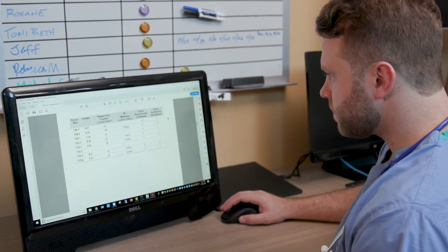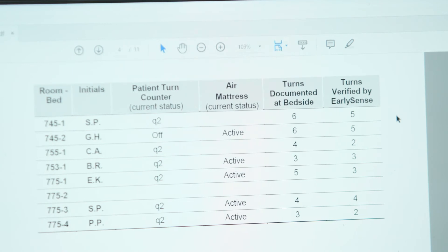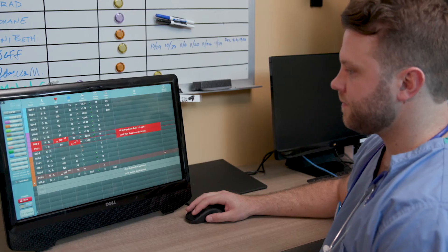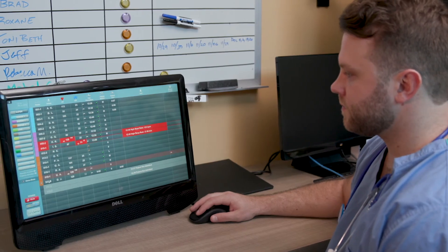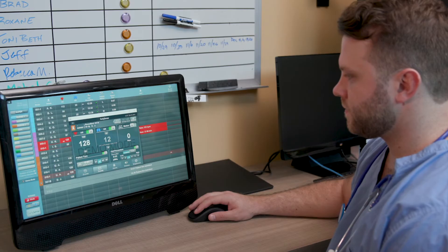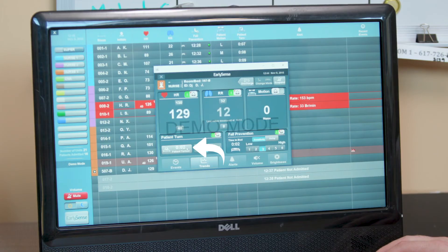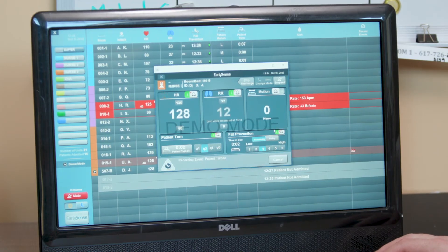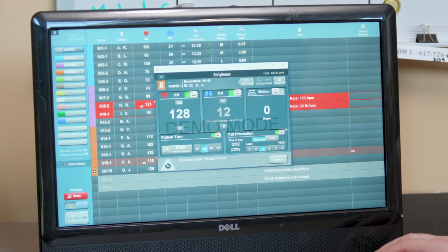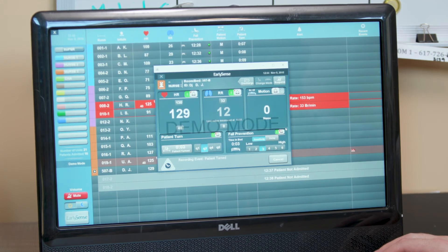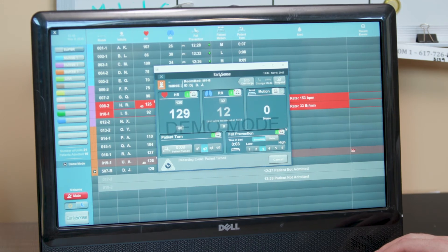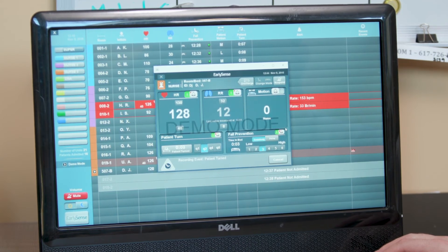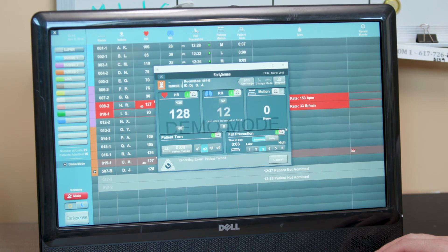If a turn is documented in the system, it can be shown on system-generated reports. To turn a resident early, simply press the turn counter on the Patient's Profile at the CDS. Note, this feature may be disabled based on facility policy. The counter resets only upon pressing this button or by the patient exiting the bed.